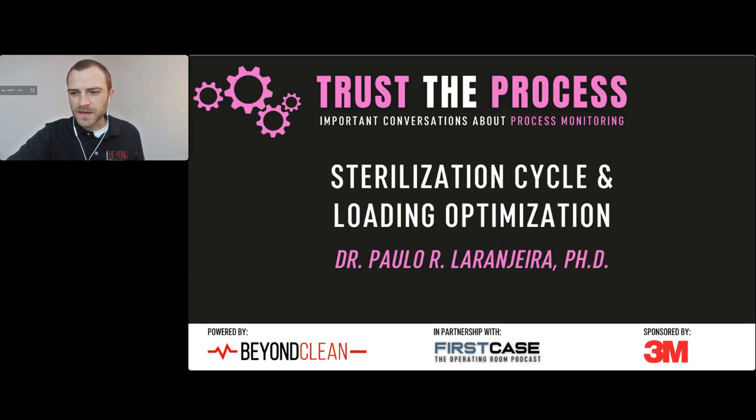First question that I wanted to pitch your way has to do with water consumption and drying time. Somebody asked, how does drying time increase water consumption for your sterilizers? Perfect question, and this is normally overseen when we install a sterilizer. We have 2 different vacuum pump systems. The most common one is the water-sealed vacuum pump.